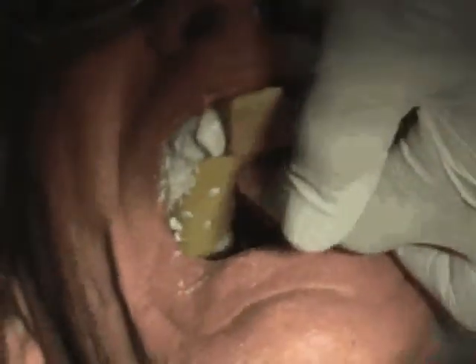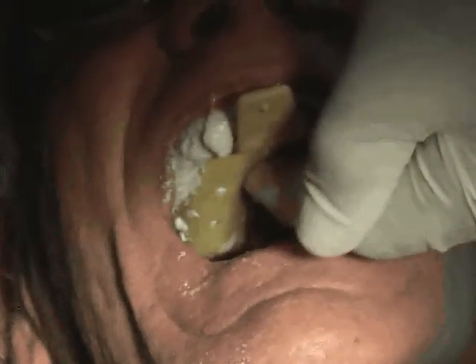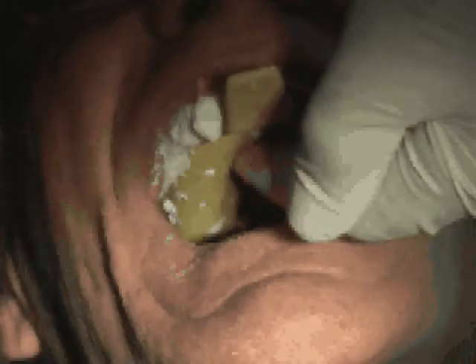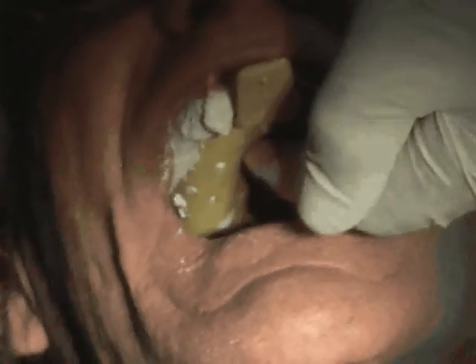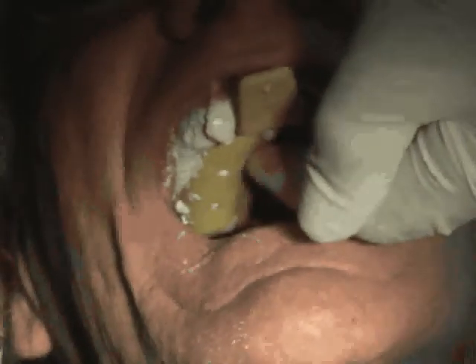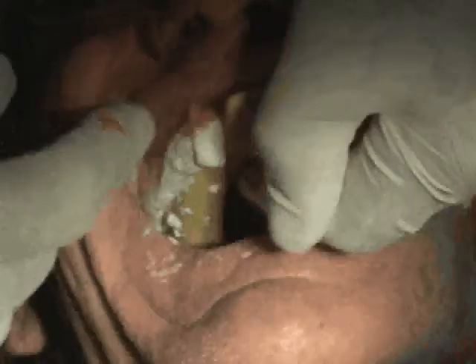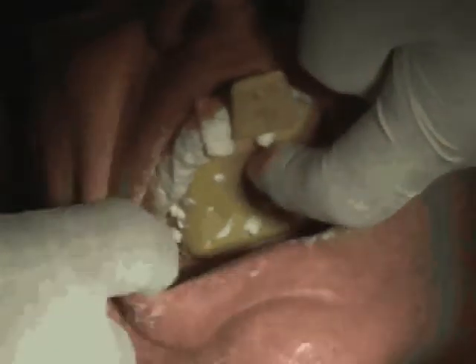And it takes only a couple minutes to set up. But you can see how one operator did this mixing. I mixed the light body and the heavy bodied and still had plenty of time to seat this into the patient's mouth. The material is already setting up. It sets up fairly fast. As you can see, it doesn't roll down the patient's mouth.